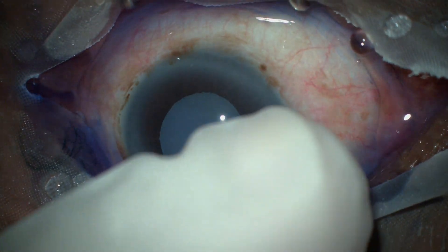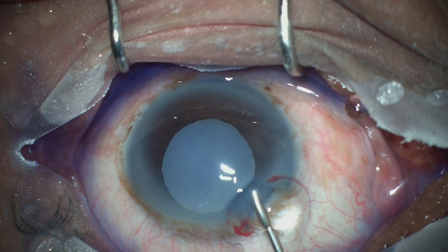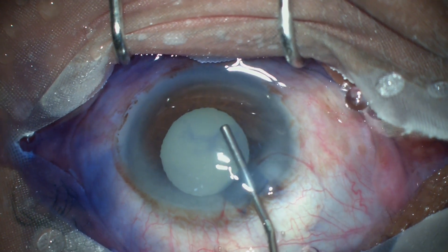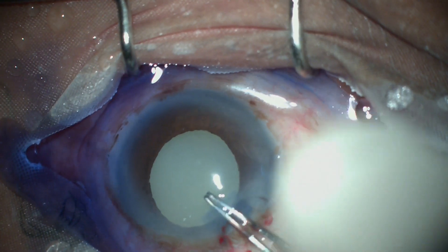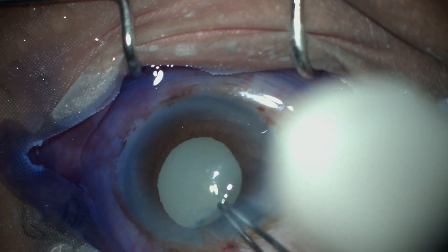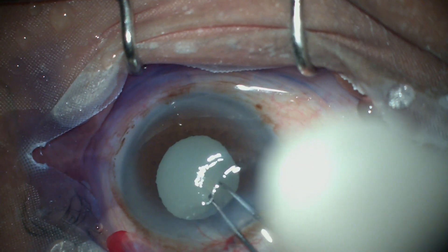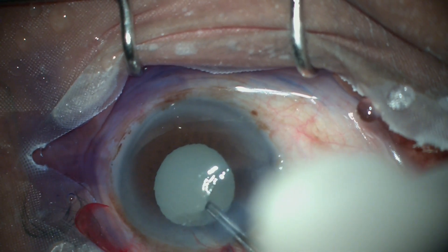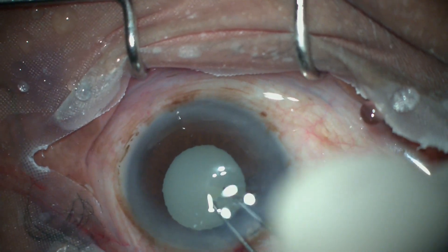Once the capsule is stained, viscoelastic is injected to inflate and deepen the anterior chamber. Then we attempt flap creation using a capsulorhexis forcep. The surprising thing is that after making a nick in the capsule, the cortex should have leaked out — but that is not what happened.